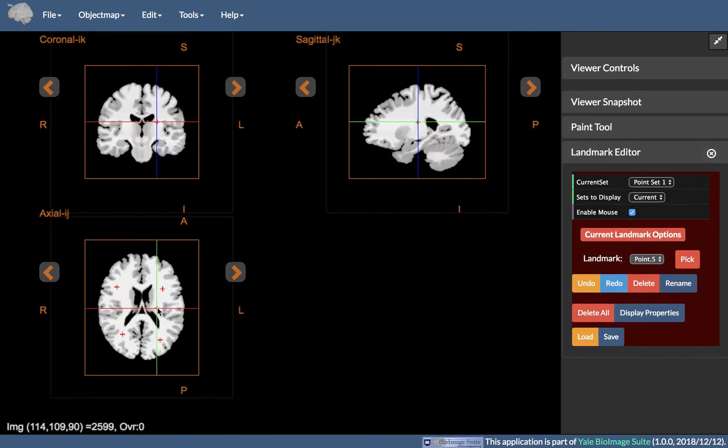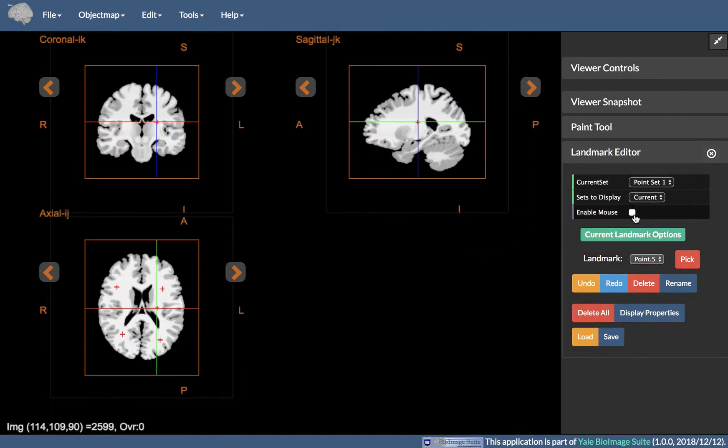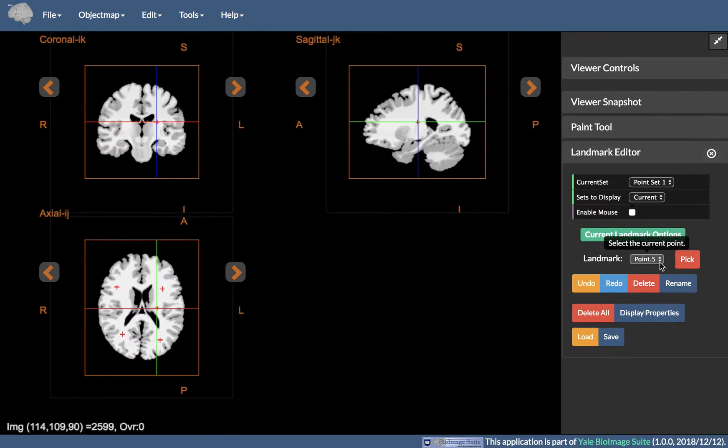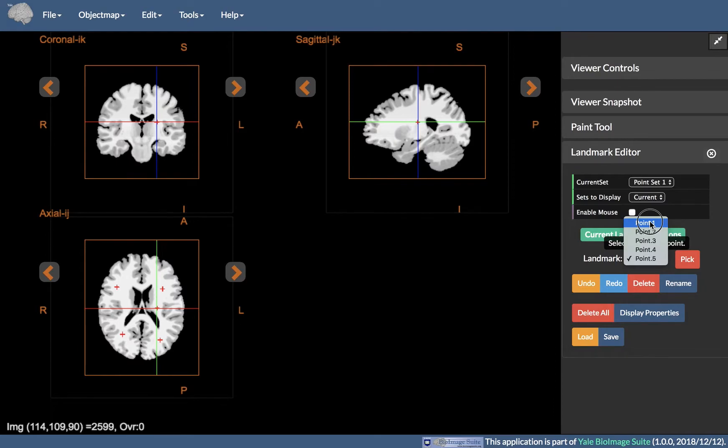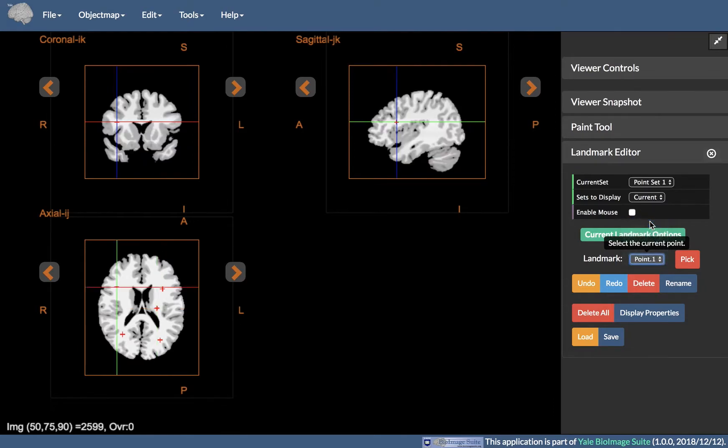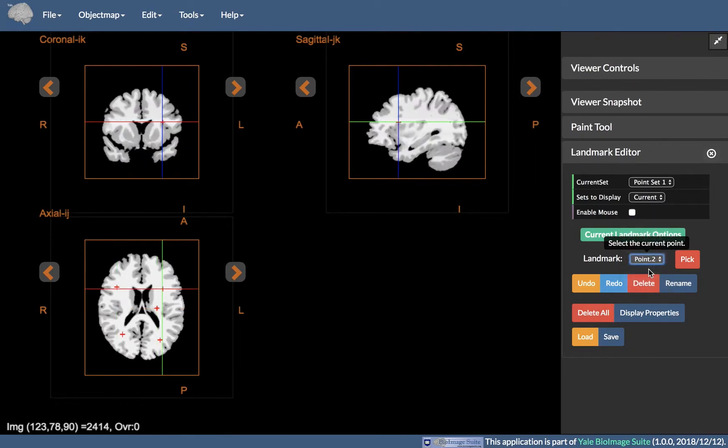The current landmark options operate on the currently selected point set in Current Set. Landmark selects the currently active landmark from the drop-down list of landmarks. Selecting a landmark will center the image viewer crosshairs on this landmark.